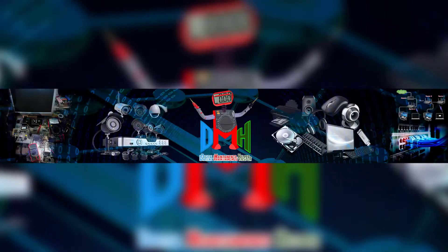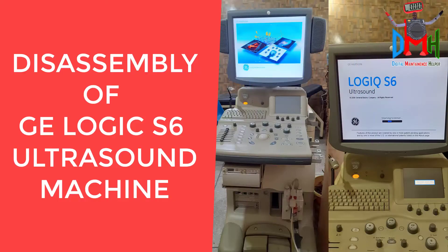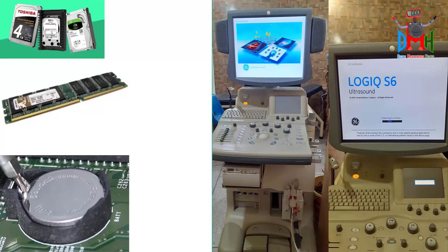Assalamu alaikum friends, I am your digital maintenance helper. Today I will guide you about the disassembly of an ultrasound machine Logic S6. I will also tell you how you can change its hard disk, RAM, CMOS cell, and how you can solve its heating problem.